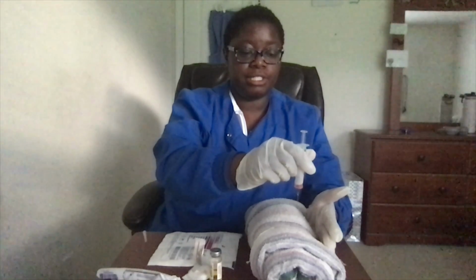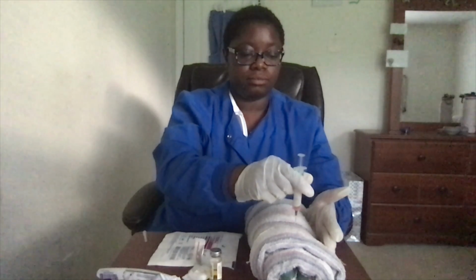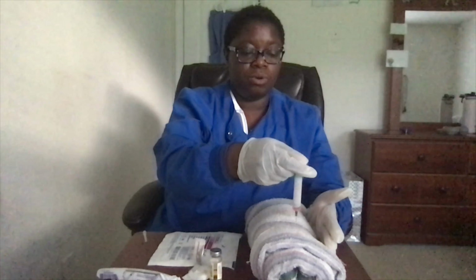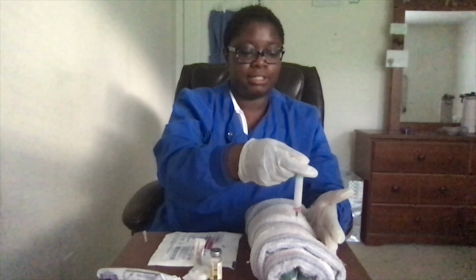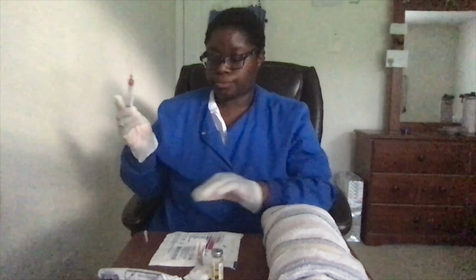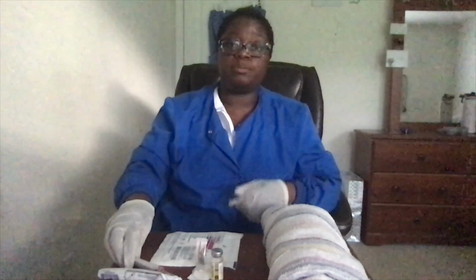Because this is an intramuscular injection, it has to be given at 90 degrees. One, 2, 3, 4, 5, 6, 7. At this point, I would take this empty needle and syringe and put it in the sharps container located inside of Anna's room.